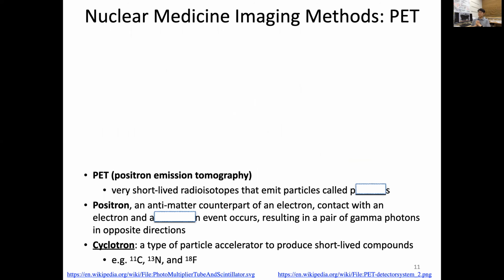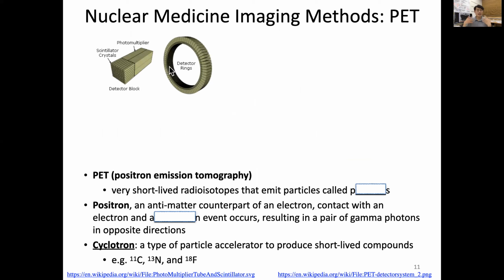So I want to discuss the imaging method of PET. First, the detector side. PET uses a detector with the PMT, photomultiplier tube, which detects the photons very fast and sensitively. However, it starts with nuclear medicine, which starts with a gamma ray. So we need to convert the gamma ray into photons. That is what we call scintillator crystals.